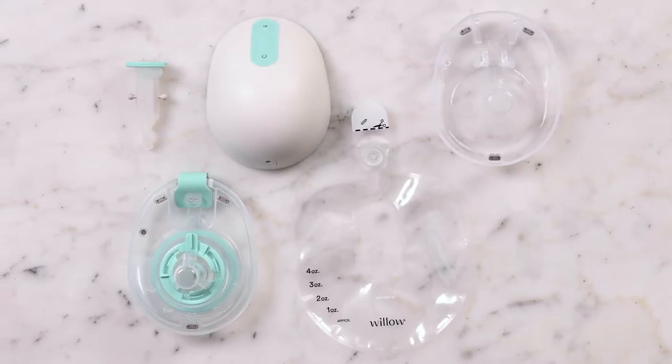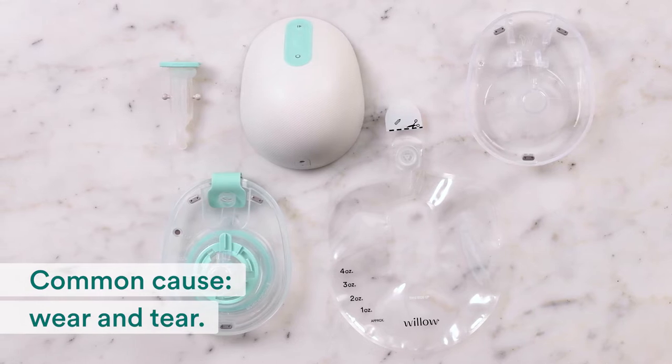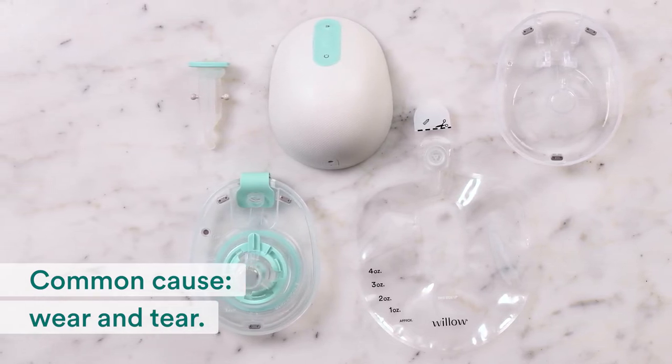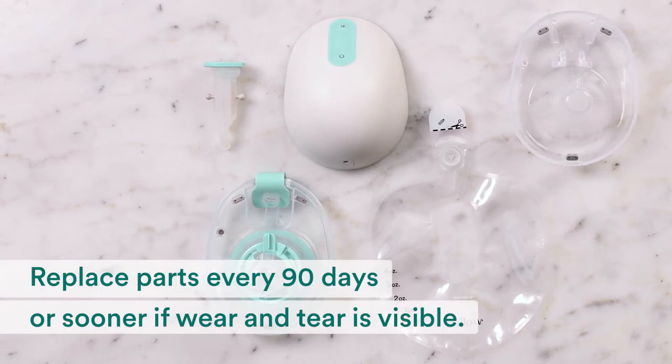If that didn't work, let's try something else. Sometimes an orange blinking light is a sign of wear and tear. Disassemble your pump and its parts to check for signs of damage, tears, or holes. Remember to replace parts every 90 days, or sooner if you notice wear and tear.